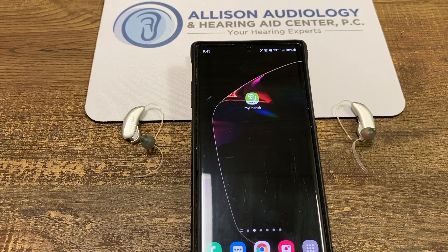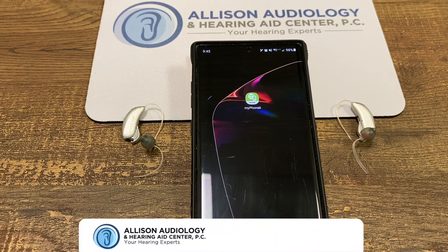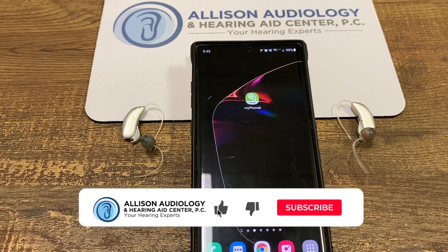All right, this is Ryan with Allison Audiology, and today we're going to be pairing the new Phonak hearing aids to an Android phone. It's rather easy. Phonak uses the standard Bluetooth.